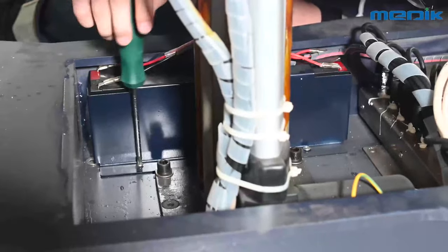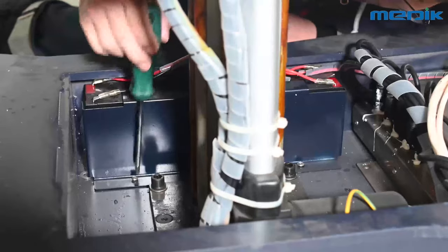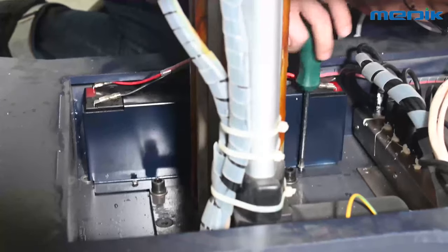Step 2: Here you will find the location of the battery. Then loosen the screw which is used to fix the fence for the battery location. Remove it out, disconnect the cable, and take out the old battery.